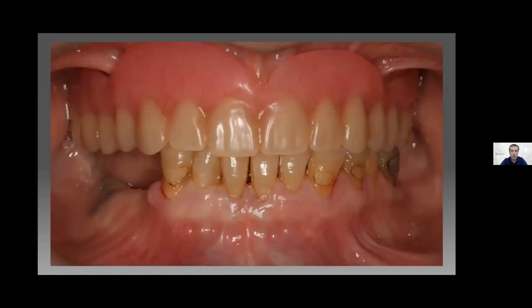So the patient came to us to replace her denture with a fixed prosthesis, so she needs implants, and in the mandible the same thing. So the decision after studying the case with the prosto department, this is a case done at the Lebanese University, and when we have complicated cases like this, we go with the prosto department and we do the planning together. Here we decided to put 6 implants in the maxilla and 3 implants in the mandible. They are divided into 13, 14, 16, 23, 24, and 26.